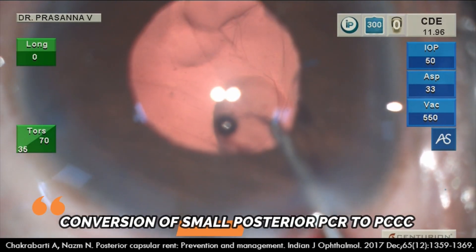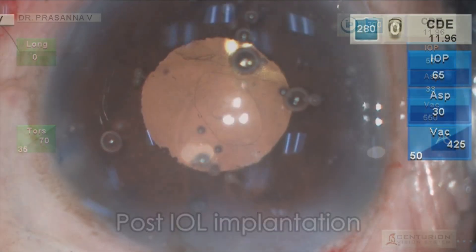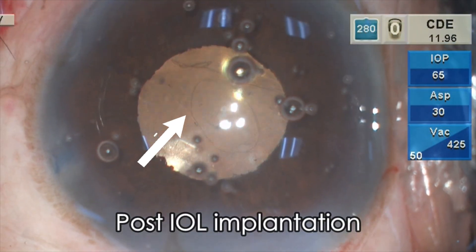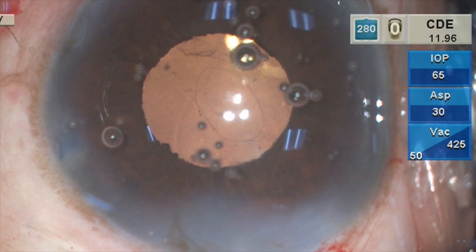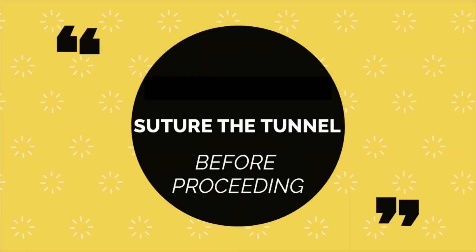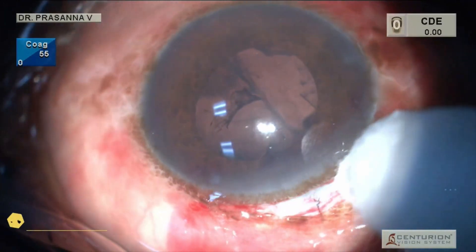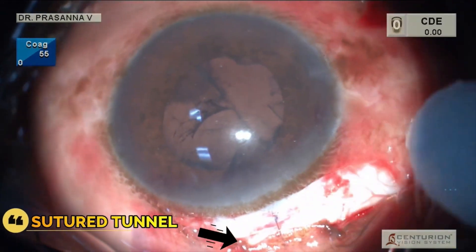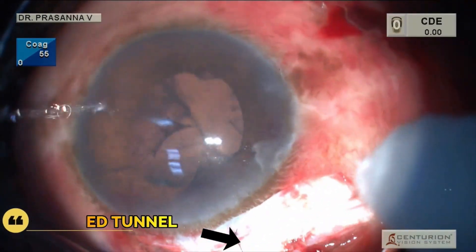We can even get away without performing anterior vitrectomy and place the IOL in the bag successfully. Once instruments are out, it is better to suture the main port both in FACO and SICS and then proceed with anterior vitrectomy. This will help to maintain the anterior chamber better.